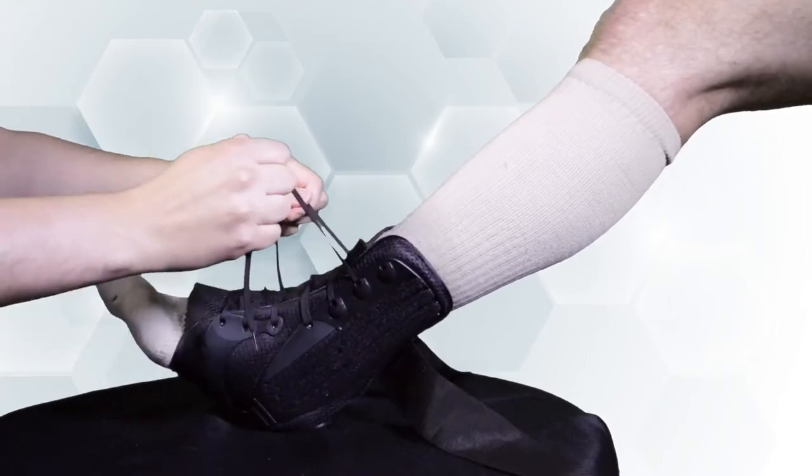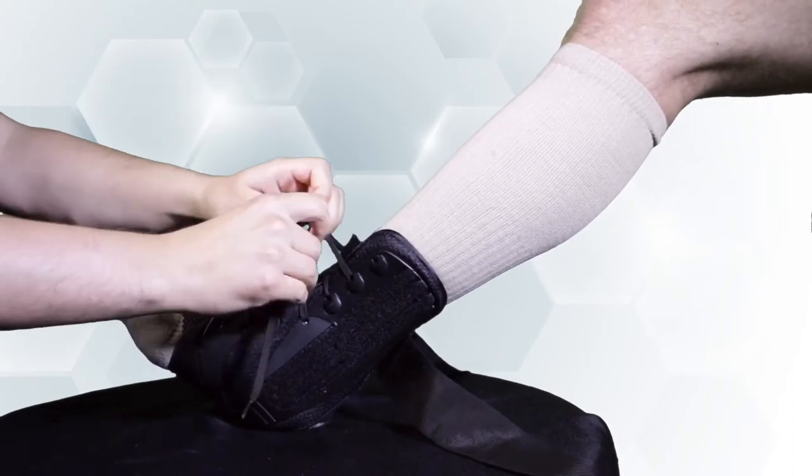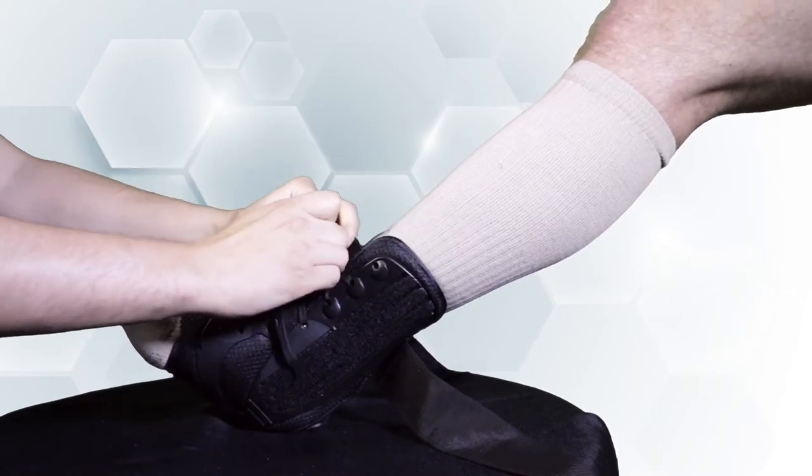Then proceed to lace up the support snugly, but not too tight, just like you would a high top tennis shoe. Then tie off in a bow, just like high top tennis shoes, getting a uniform snug fit all the way up.